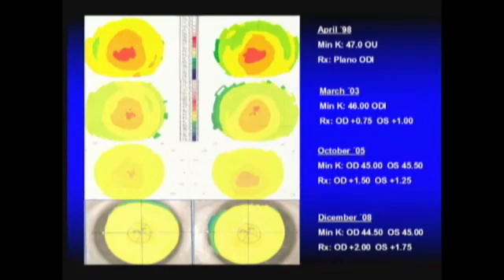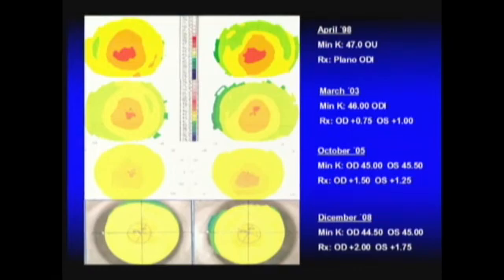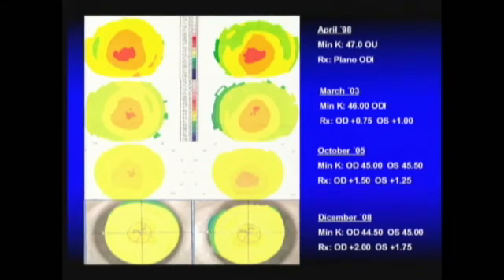In 98, the K was 47, and the refraction was plano. Five years later, the K went from 47 to 46, and he started manifesting some hyperopia. Two years later, 46, 45, 45.50, and look at the topographies. 1.5, 1.25. In December 2008, 10 years after the procedure, 44.50, 45, very close to the original K and very close to the original refraction. They not only lose K readings, they also lose the power that was induced in the cornea.